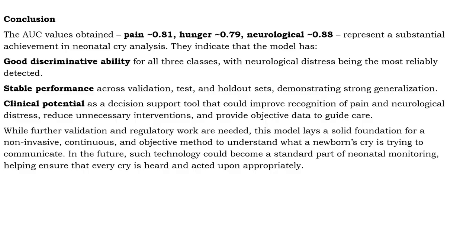The stable performance across validation tests and holdout sets demonstrates strong generalization, and clinical potential as a decision support tool that could improve recognition of pain and neurological distress, reduce unnecessary interventions, and provide objective data to guide care.